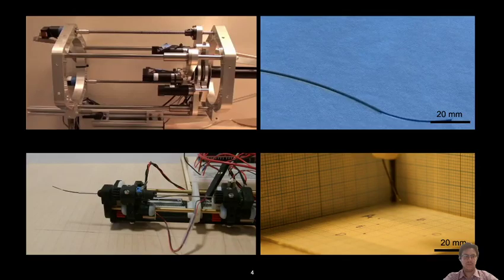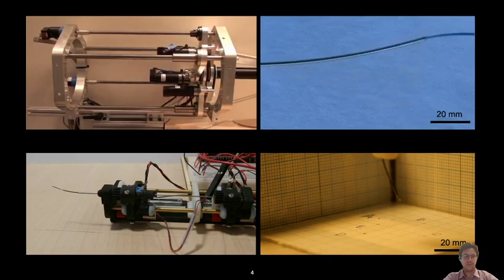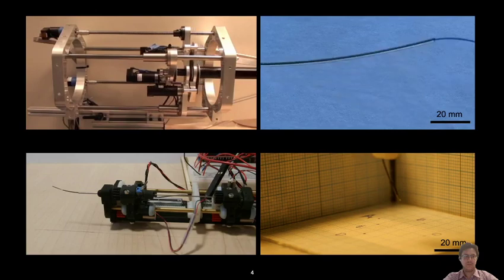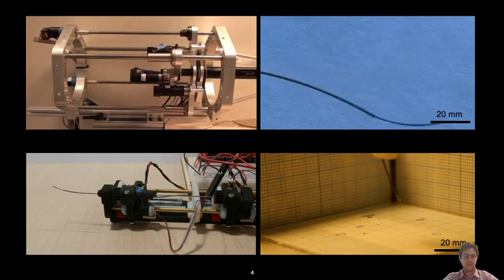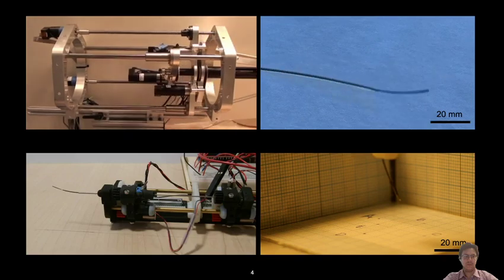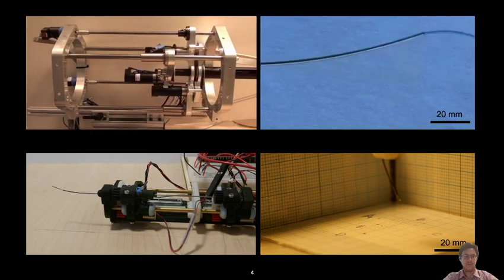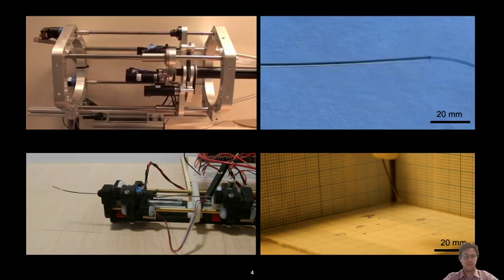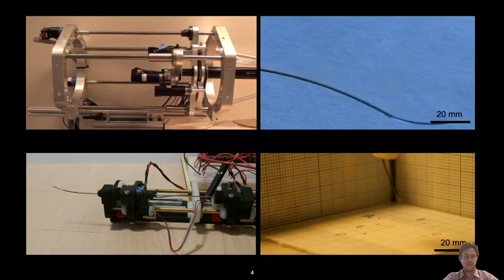This approach is better illustrated with these videos. The top row shows a large-scale system — dimensions like a catheter in terms of diameter — from the lab of Pierre Dupont at Harvard Medical School, Boston Children's Hospital. The tubes are grasped from the back, inserted, and telescopically translated and rotated with respect to one another, giving rise to snake-like motion of the end effector. We have shown that you can very nicely control both the shape of the robot and its position, and even adjust stiffness to minimize or maximize force application.